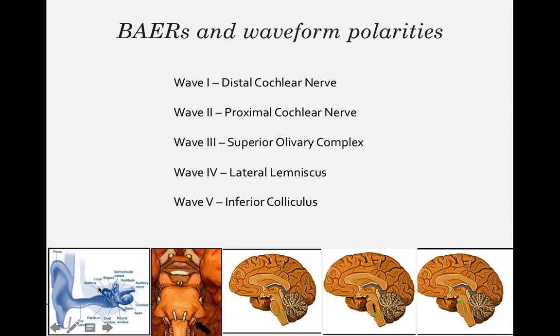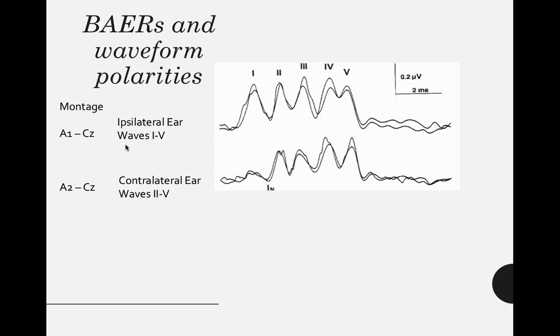We're going to look at these pictures in more detail, but we have 1, 2, 3, 4, 5, and if you look in there, you see exactly where the signal is being generated within the anatomy. And this is something you're going to have to memorize. There's no easy way to commit this to memory. You have to just commit this one to memory. There is a very useful acronym, which we're going to talk about in a second. But first, let's continue with this.